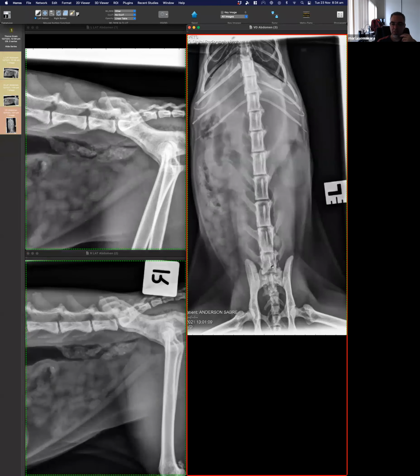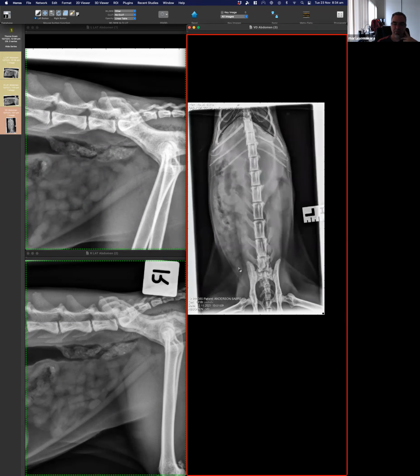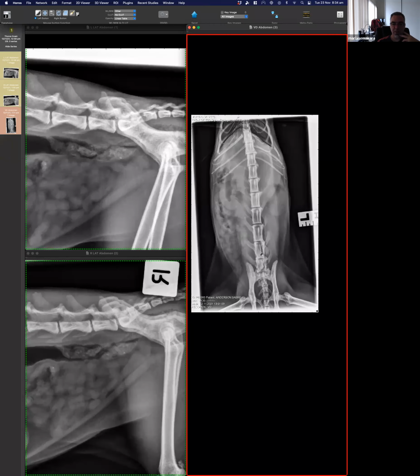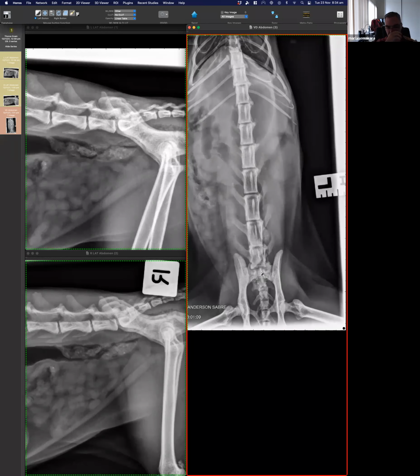Yeah, I have to give you credit, I remember struggling with it. The pelvis and the sacrum are difficult structures. And I remember situations where we were after an aggressive lesion. So, for example, it would be a transitional cell carcinoma, and we're looking for mets, or a prostatic carcinoma or some aggressive neoplasia. And we were trying to define if we believed that there was an aggressive lesion in the sacrum or the pelvis. And sometimes it's bloody hard radiographically. Then you CT them and you see the lesions there jumping at you and very, very clear. So it's a confusing structure and it's a difficult structure.